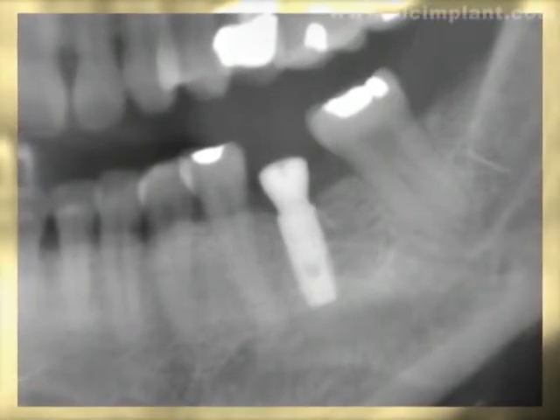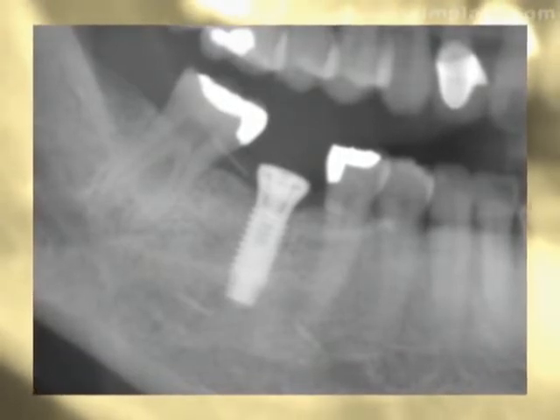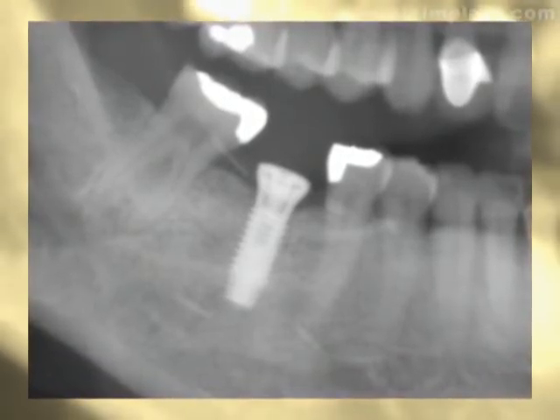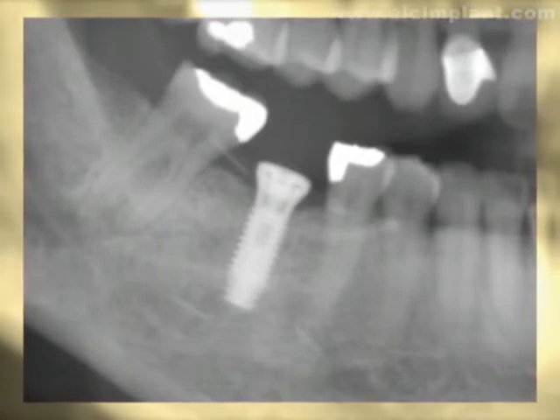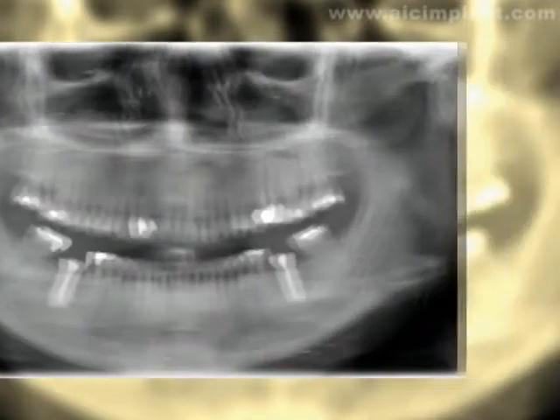You probably think that this surgery is a very simple case. Note, however, that the incision design for the flap must be determined based on the mucogingival junction to secure sufficient attached gingiva at the buccal side.